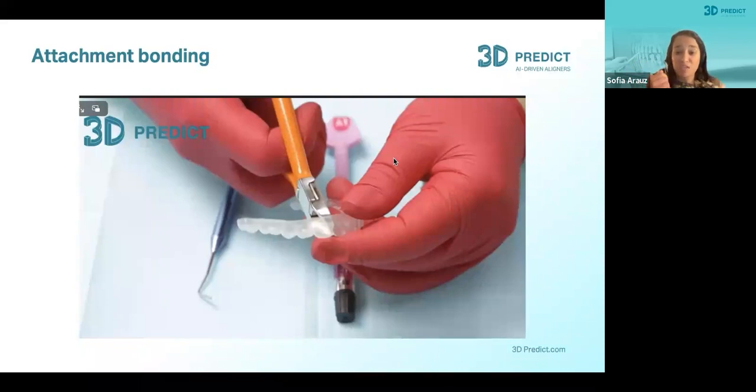But if you want to be extra safe, you can always buy food grade silicone spray. Food grade silicone spray you can acquire at different retailers like Walmart or Cabela's or Amazon, etc. So what you would do is put it on your felt tip and then add it just on the area of the attachments that are on the template. Just right there, very lightly, to make sure you have some lubrication so the attachments don't stick to the template.